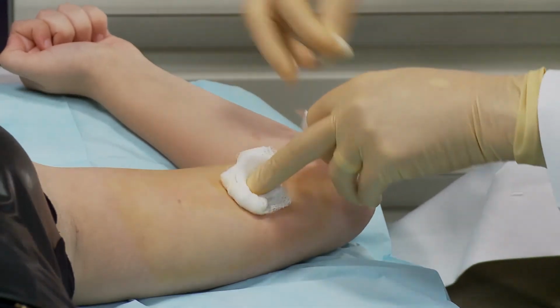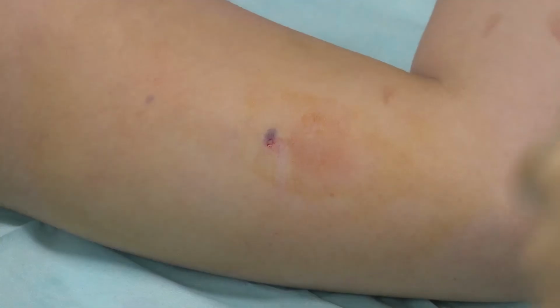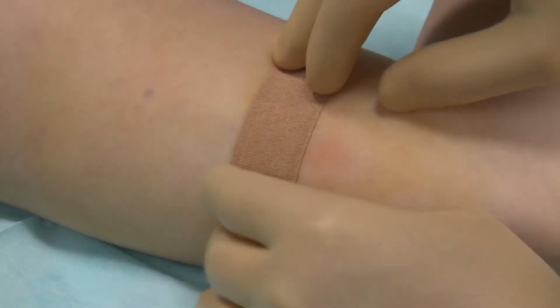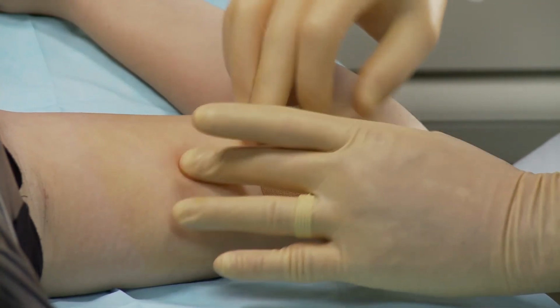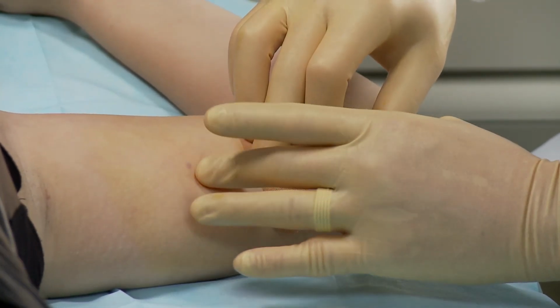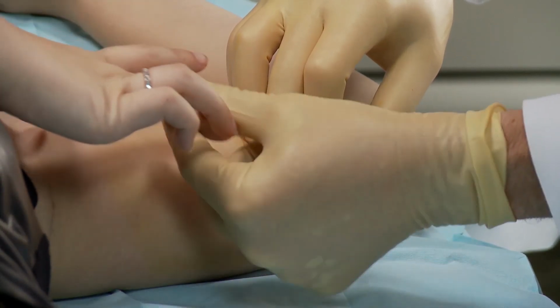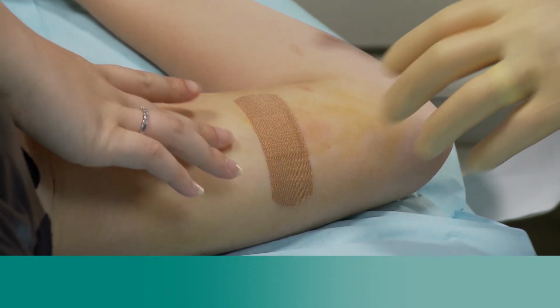Place a small adhesive bandage over the insertion site and palpate the implant. Always verify the presence of the implant in the woman's arm immediately after insertion by palpation. By palpating both ends of the implant, you should be able to confirm the presence of the 4-centimeter implant. Until the presence of the implant has been verified by palpation, the woman should be advised to use a non-hormonal contraceptive method, such as condoms. Also request that the woman palpate.